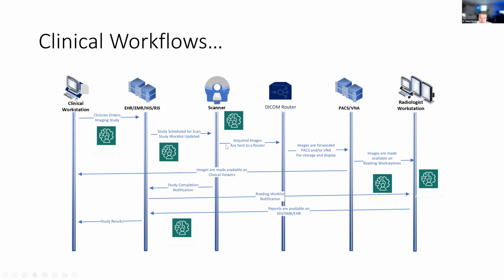At the time of the completion, when the scan is completed, even though images are being sent asynchronously, when the technologist who's performing the scan completes the exam, that will most likely produce a trigger on a reading work list on a radiologist's workstation. And there, the radiologist will open that exam for viewing.